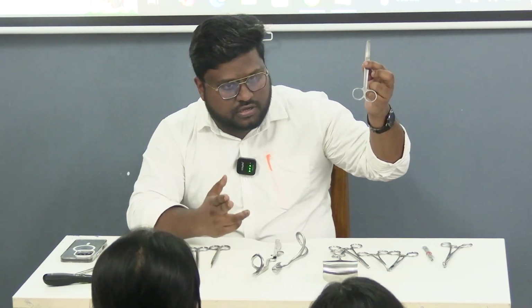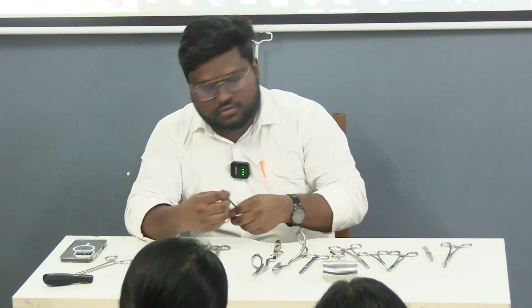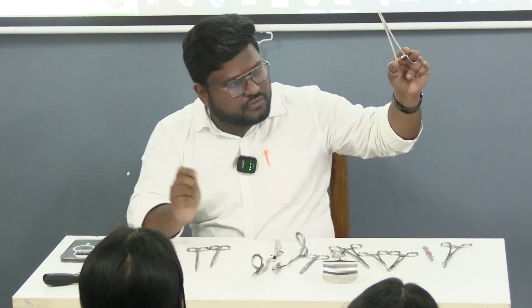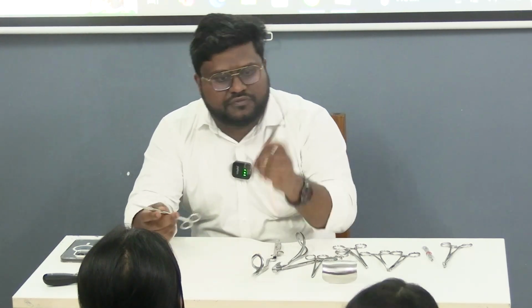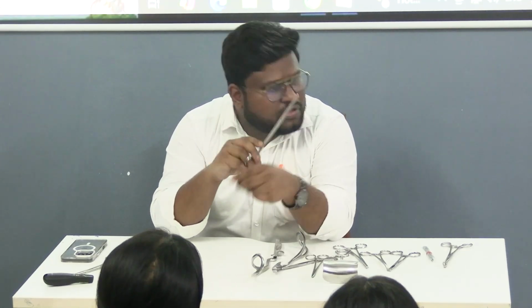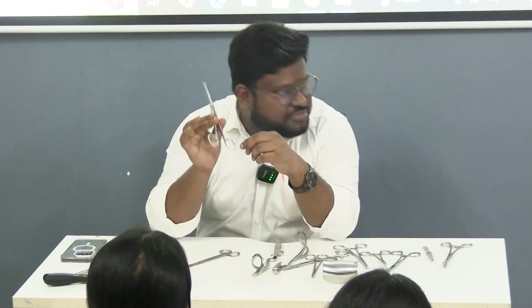Scissors, blunt scissors, for cord cutting and suture cutting. Needle holder for holding the sutures, suturing করার সময়। And finally we have sharp dissecting scissors. যে কোনো ডিসেকশন, কোনো অ্যাডেশন আছে ডিসেকশন করবো, বা পোস্ট সিএস প্রেগনেন্সি, রিপিট সিএস প্রেগনেন্সি, there will be adhesions. So for dissecting the adhesions we require sharp scissors, not this blunt one. We need a fine scissors.